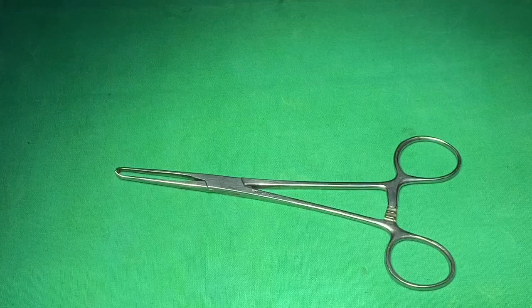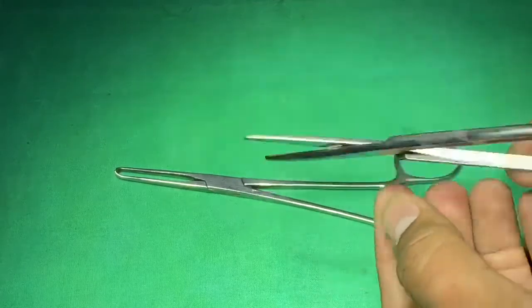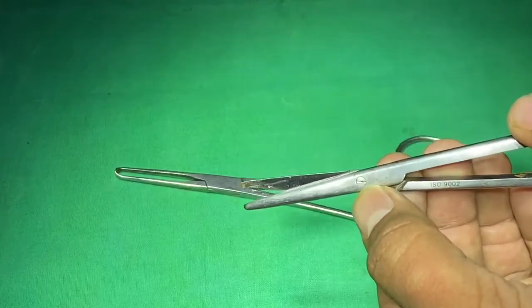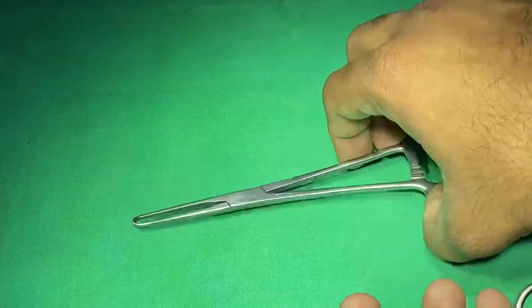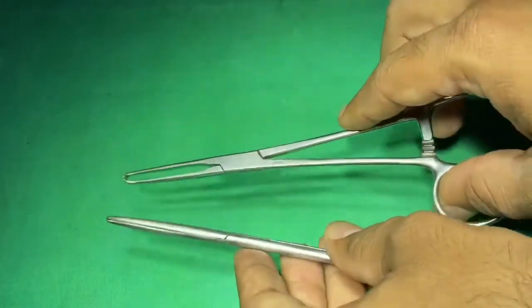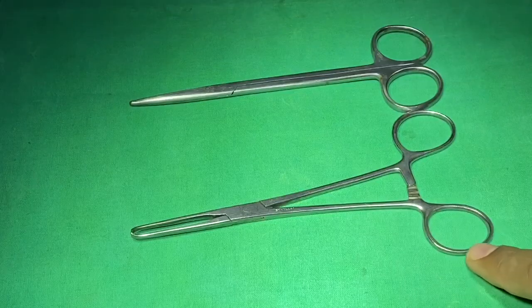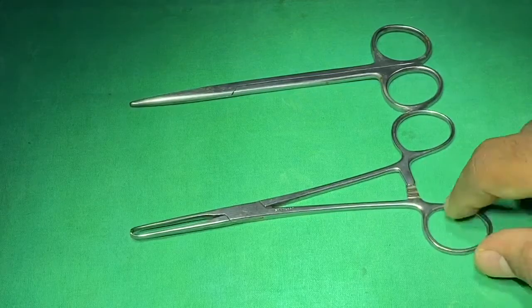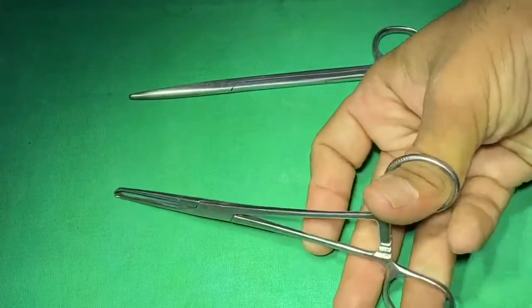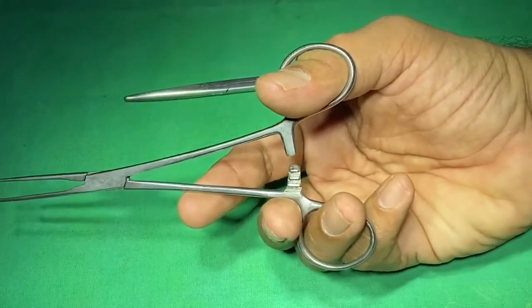In some other instruments — here I have taken a straight scissor — the two shafts are joined with a screw, so this is called a screw kind of fulcrum. This is the box kind of fulcrum, this is the shank, this is the finger ring, and this is the ratchet. There are three lockings; usually one or two locks are commonly used.